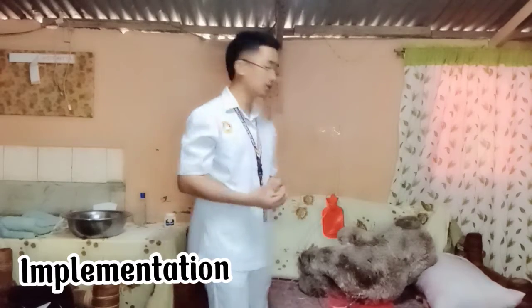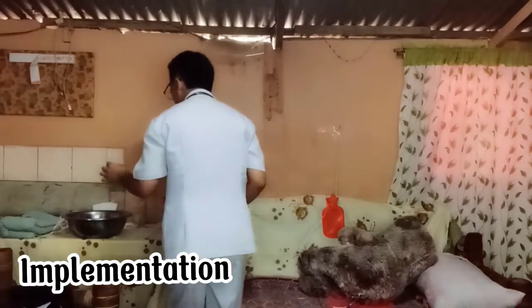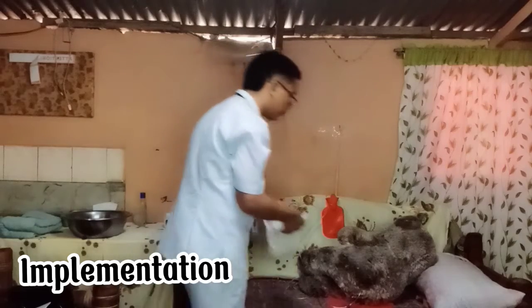Okay, so after that, if you are using a plastic commercial container, roll it up as the fluid is instilled. After all the solution has been instilled, or when the client cannot hold anymore and feels the desire to defecate, close the clamp and remove the rectal tube from the anus. Then place it on the disposable towel as you withdraw it. Okay, so we're going to place the disposable towel here.